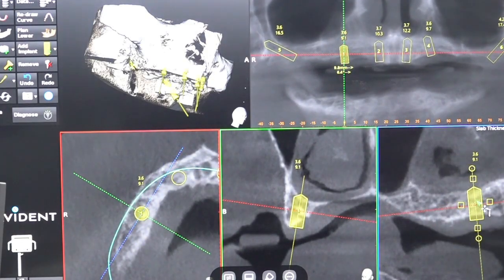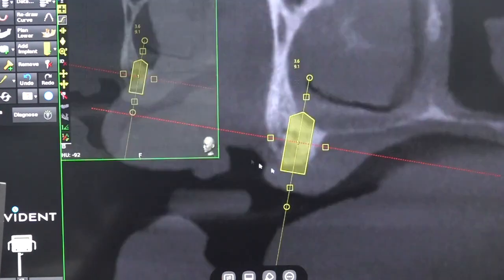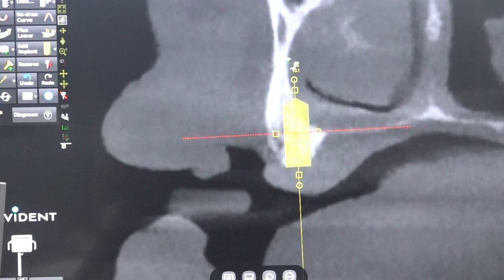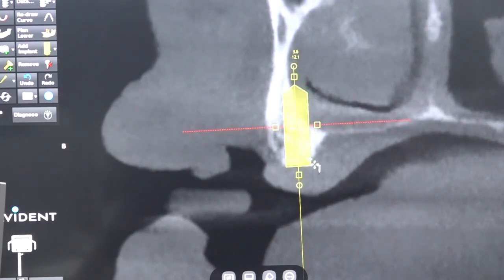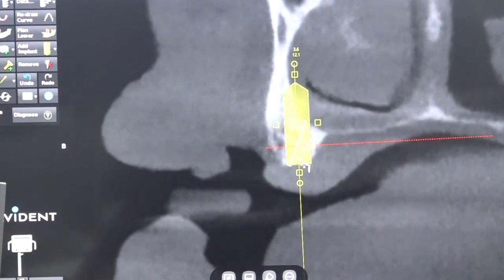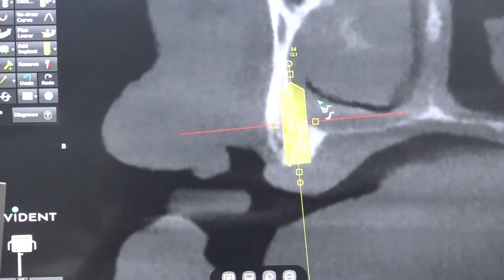Now we will go to the first premolar area. Just in the first premolar area, we are getting this pillar here. It is the nasomaxillary buttress or canine column. The bone is a little bit increased towards the buccal aspect, not on the palatal aspect. Still, towards the palatal aspect, the bone is 7 mm only. Maybe if we go abutting the labial aspect, you may get 11 or 12 mm. The two are not great.